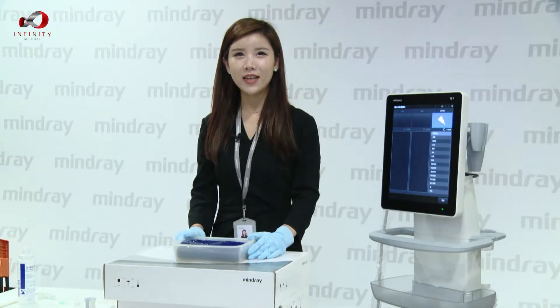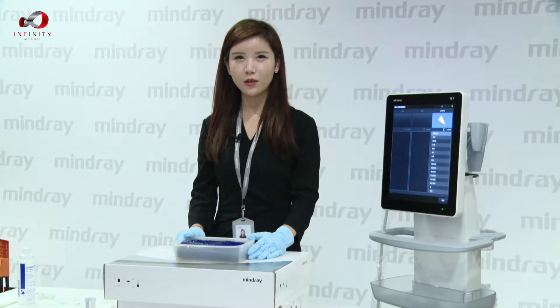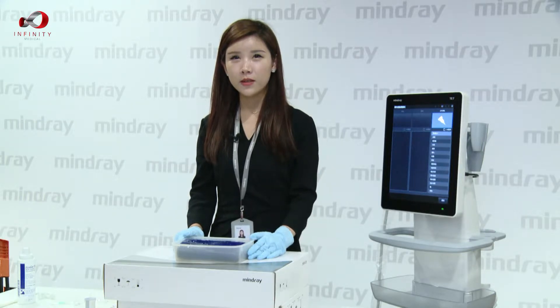Hello everyone. Today I would like to show everyone how to perform the E-spatial Navy function. Before we start, we need to prepare the environment for the demonstration.